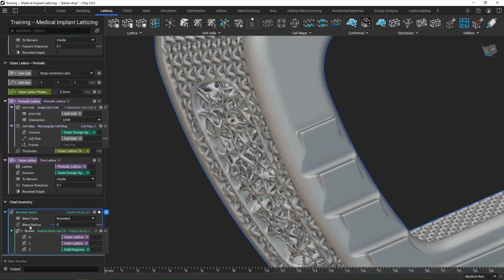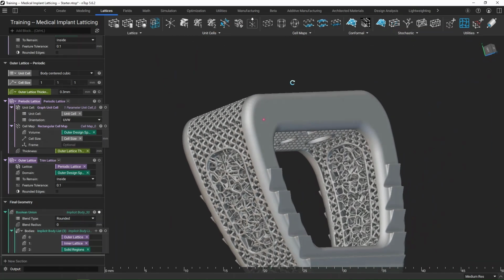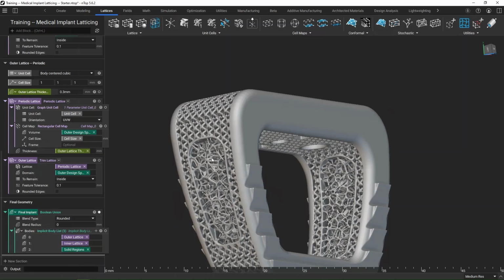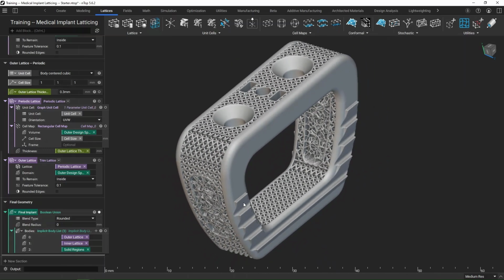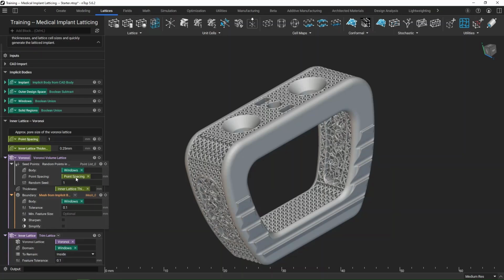If we wanted, we could even add a nice blend radius here. Of course, we'd have to then trim it back to the original space so we're not overpopulating anything. But this kind of looks nice for me right now. So I'm going to go ahead, make that a variable, call this my final implant. So far, we've created that Voronoi lattice in those windows, lightweighted this geometry by adding a periodic lattice in that outer design space, but then also brought back in those solid regions that we were working on before. And so I feel pretty good about this workflow.